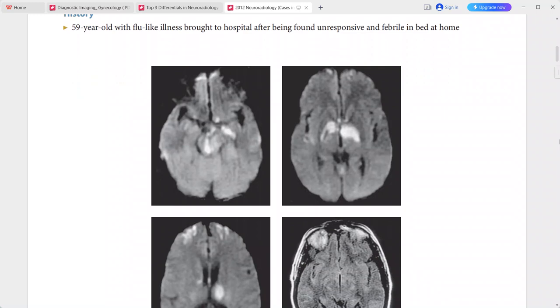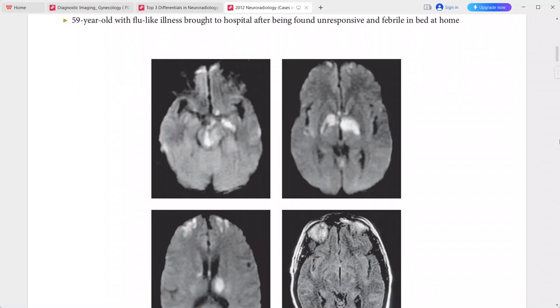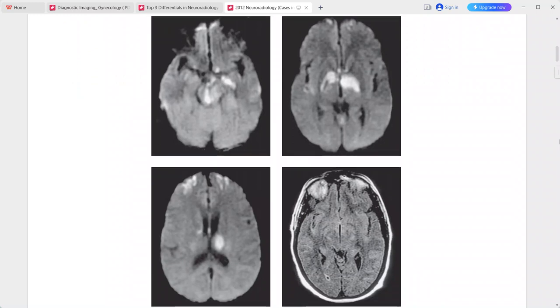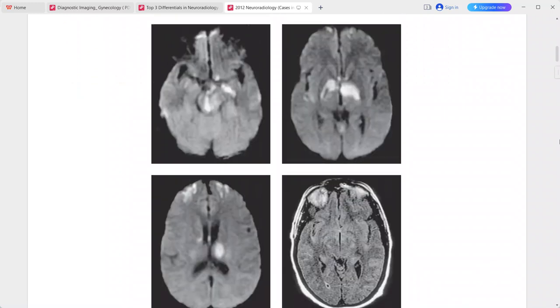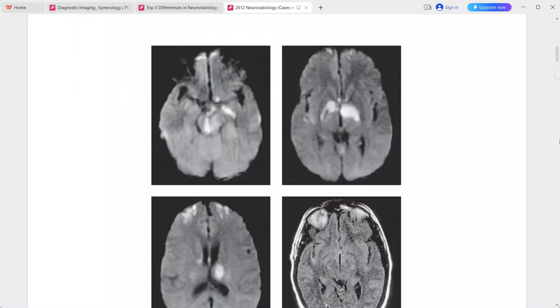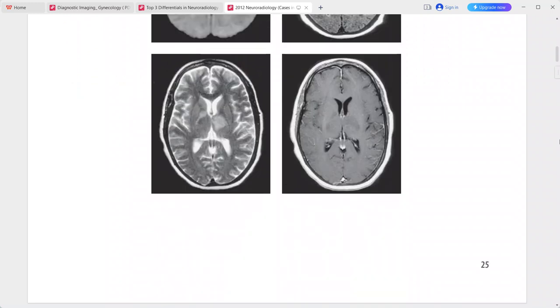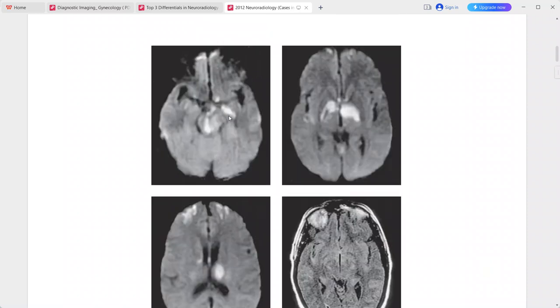Next case: 59-year-old with flu-like illness, found unresponsive and febrile at home. There are areas of decreased diffusion and hyperintense signal on T2-weighted images in the brainstem, lentiform nuclei, internal capsule, thalamus, and bilateral frontal lobes.